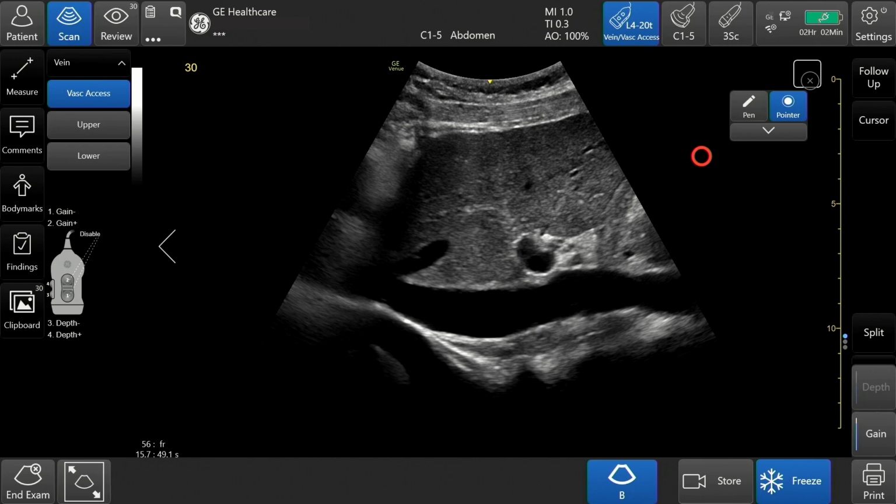While teaching or presenting, use Pointer to actively point out areas of interest. Tap the camera to capture the image, including the pointer. Using this function captures a screenshot, and no changes can be made to the stored image or pointer.